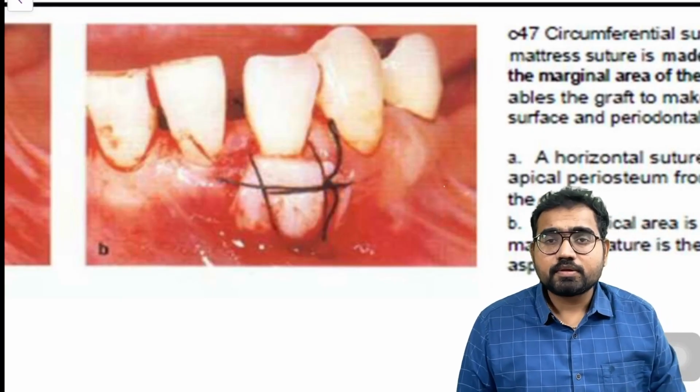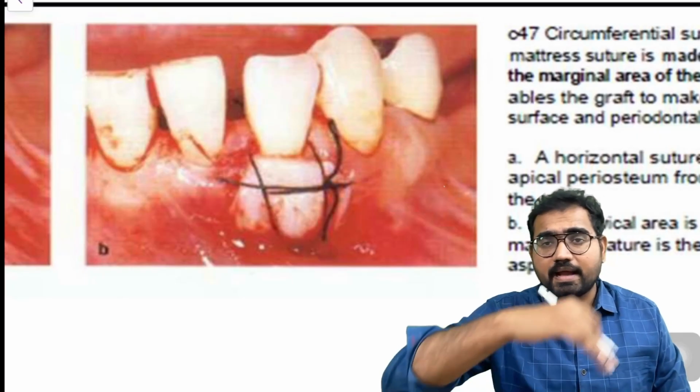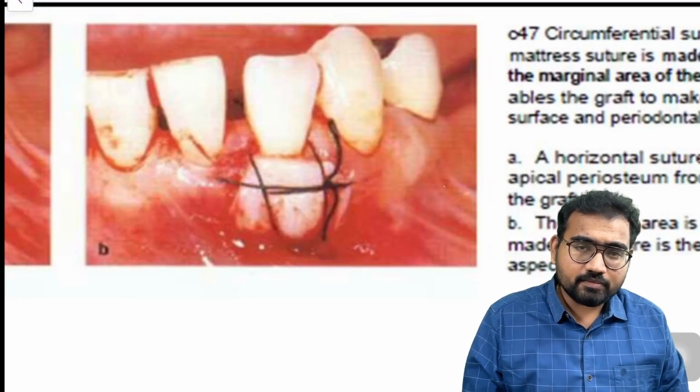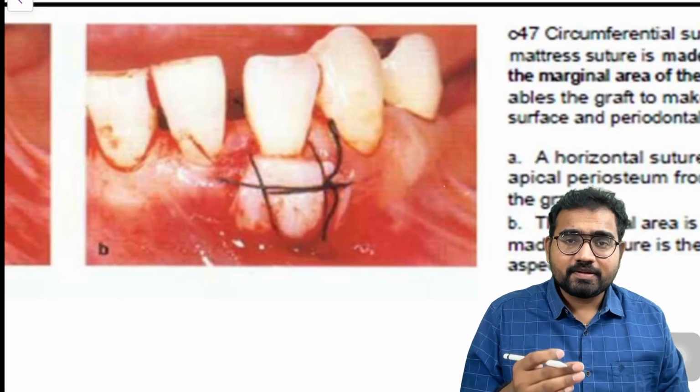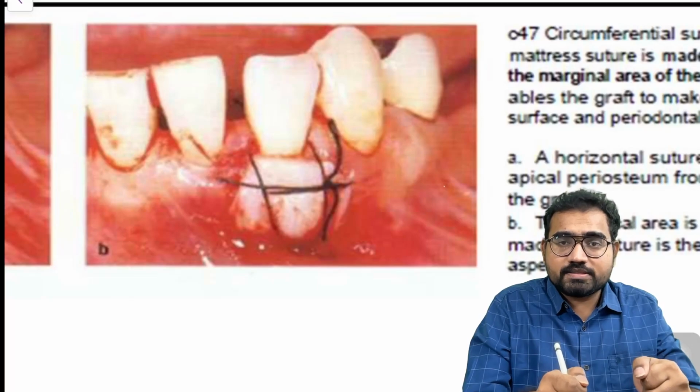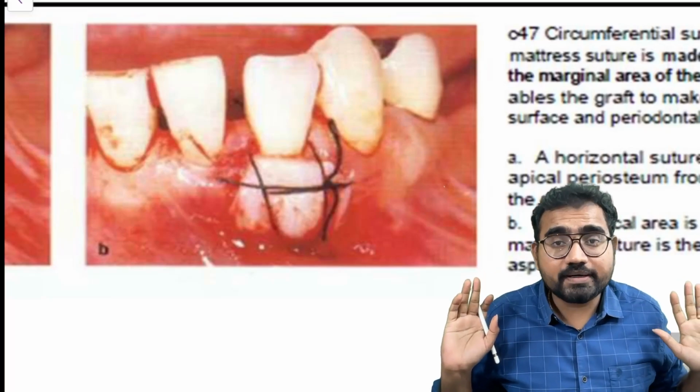Okay, like an anchor suture or a sling suture. I'm taking a bite in the periosteum and encircling the tooth. I'm pressing the graft towards the area and suturing it off to avoid dead space.